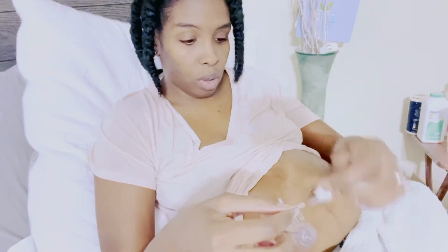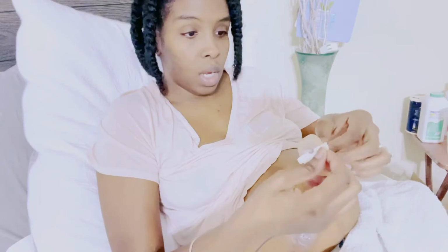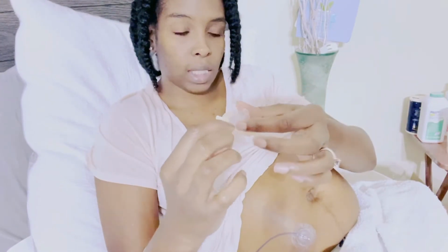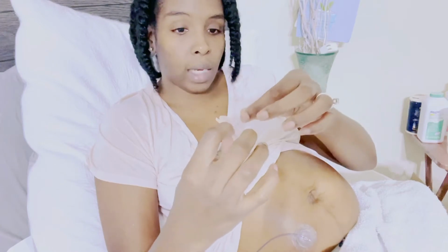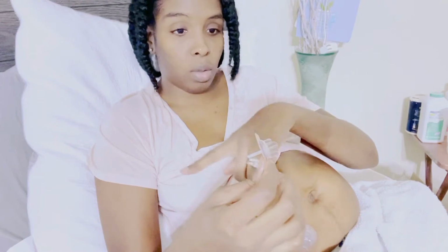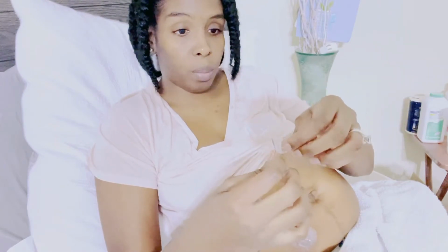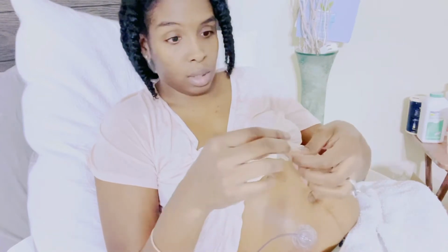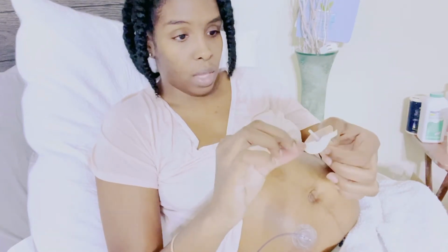So you just peel this off. You hold it here on this middle tab. Do not push these, because if you accidentally push these too tight, you might disperse the needle from the catheter piece, and then you have to get a new one because you've already dislodged the needle from the catheter that goes inside.